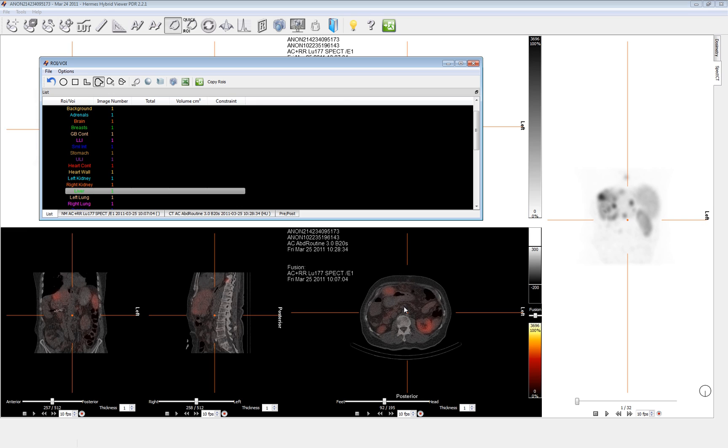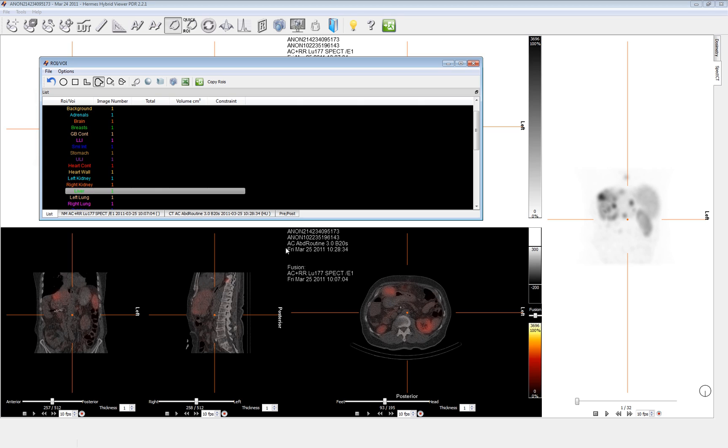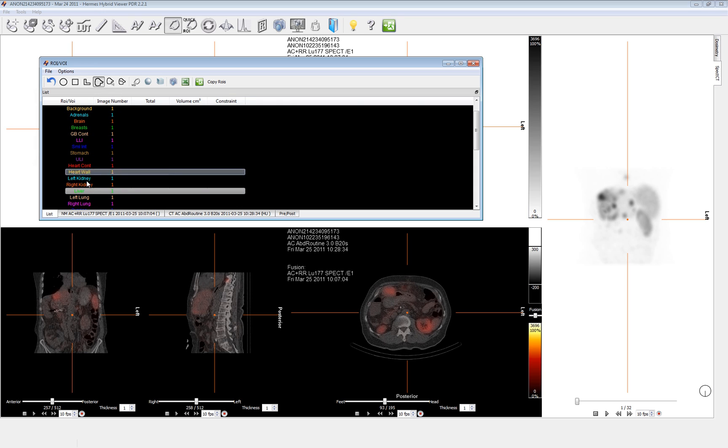You'll also see the extent of your VOI and this will show you a good idea of just how much more you have to do. So I want to pick somewhere close to the top of the liver. I'm not going to actually show you the entire drawing process as after the first few slices it's going to become very evident. We'll cut away for a second and when we come back all of them will be done. But let me show you the basics. There's a circle, a rectangle, a rubber band method, and finally freehand which is what I'll be using.